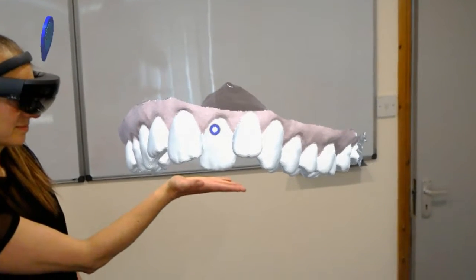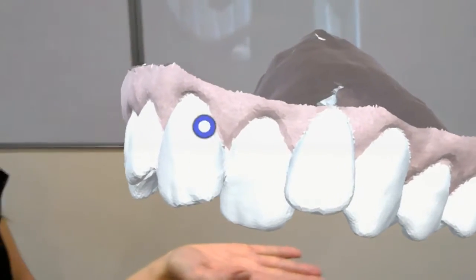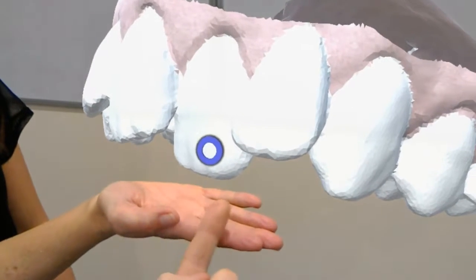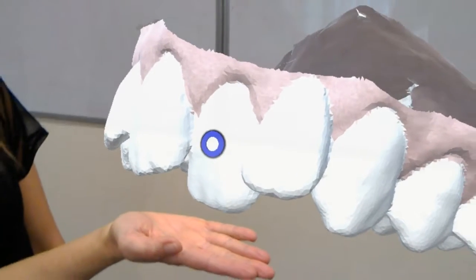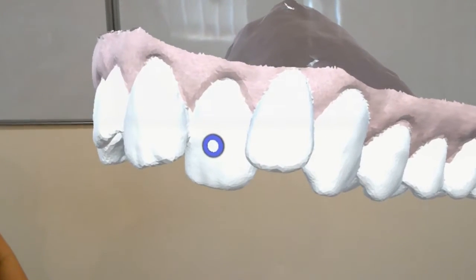That's it. So Lynn's just put her hand underneath where those two front teeth are, and if I then just zoom in, we can see that it's this tooth here that we're really focusing in on. I'll just put my little blue dot on it there. That's the tooth that we're looking at.